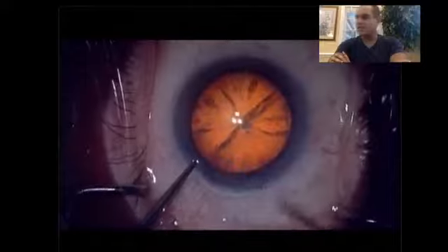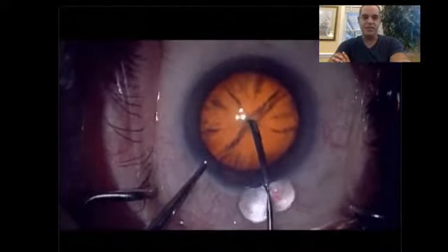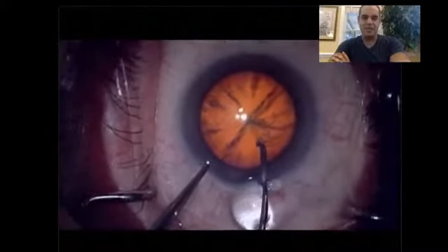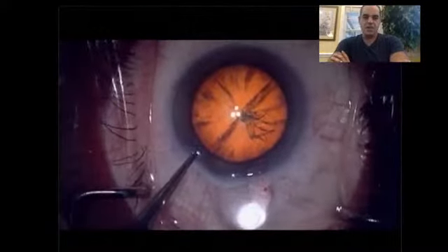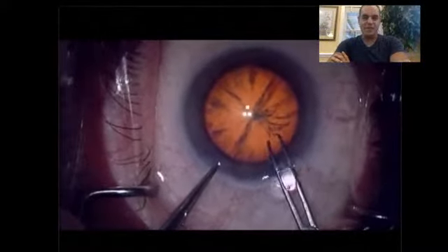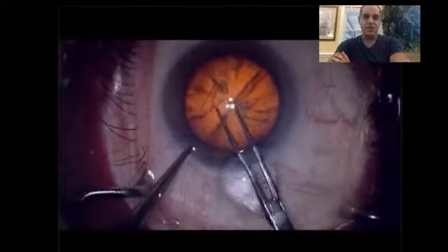By stabilizing the globe with the 0.12 forceps like that, you really get to have good control of what's going on. You don't have to worry about the patients moving or looking one way or the other while you're in the middle of trying to do your capsulorhexis, and it really does give you a lot of confidence as you do this part of the procedure.